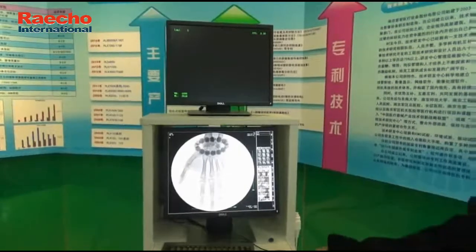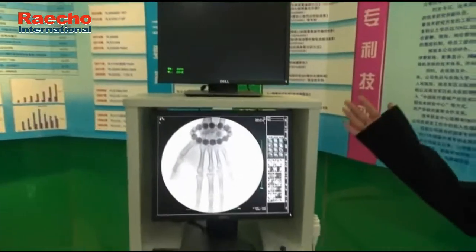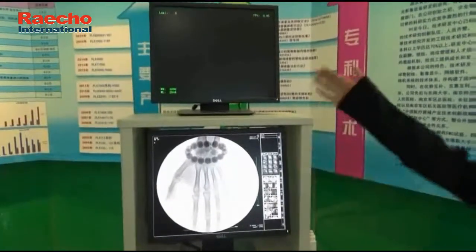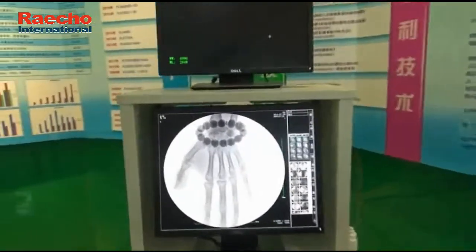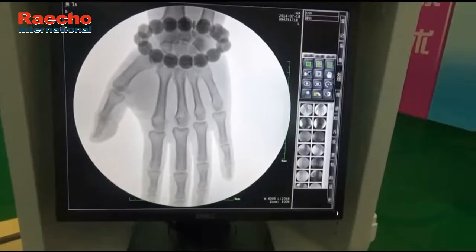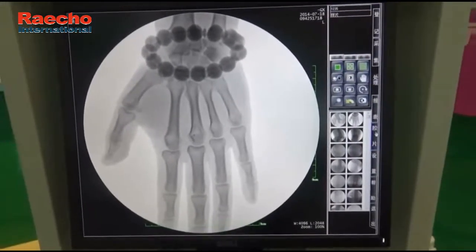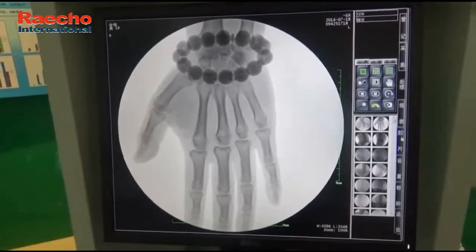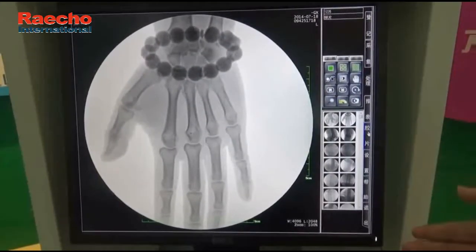Finally, here is the standard workstation of PLX-112B. It comes with two liquid crystal displays — the lower is the main screen while the upper is auxiliary. This machine integrates the functions of registration, acquisition, processing, reporting, and printing. It has a standard DICOM interface which can be connected with the hospital image network, bringing great convenience to doctors' work.